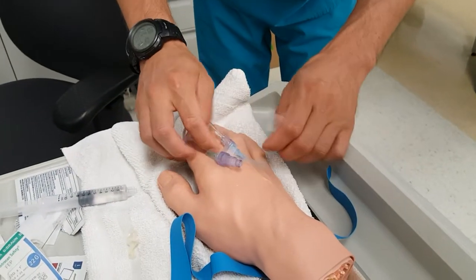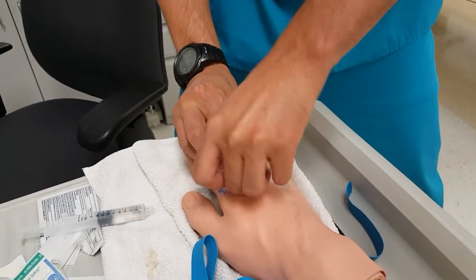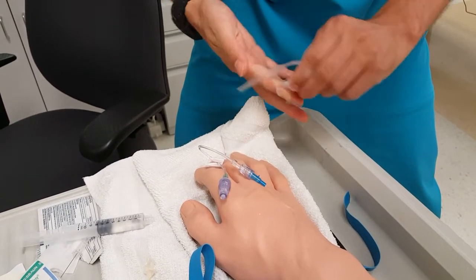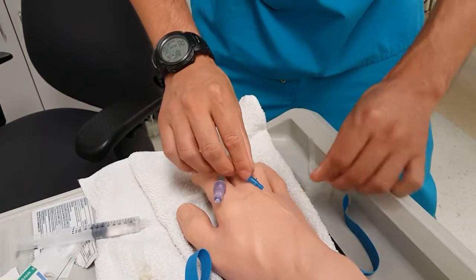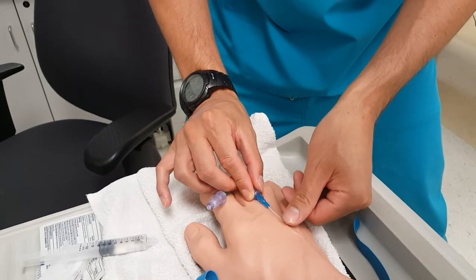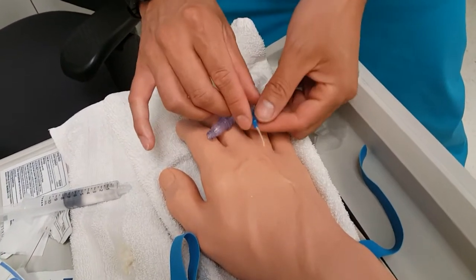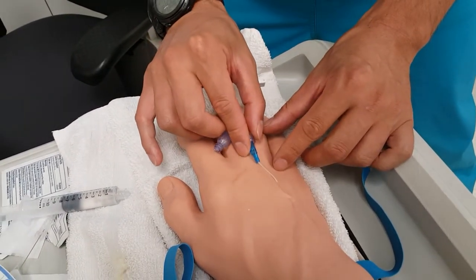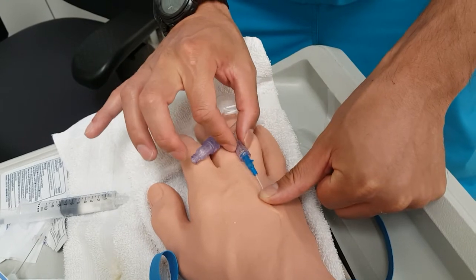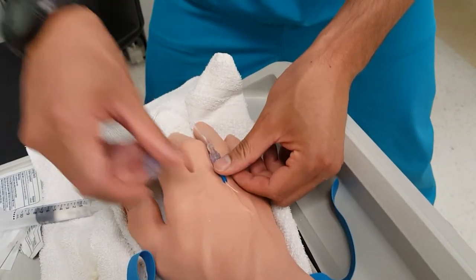Some of you might have a problem when you start the insertion and you're at the point where you need to occlude — sometimes people think they're occluding but they're not. A good trick: after the insertion, occlude using about two thumbnails' worth of distance as your estimate so you know where to stop the bleeding. From there, take off the tourniquet, add on your extension and screw it in, then secure. Then you've got your IV. Let me know if you have any questions. Thanks.